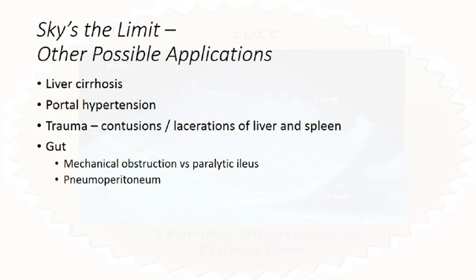Once you get the hang of how to scan, how to do point of care ultrasound, you can easily explore. You can study, and believe me, it's actually not difficult to do a great deal of abdominal ultrasound.